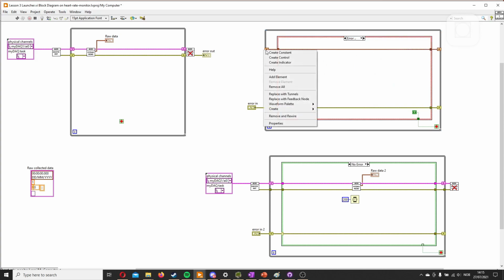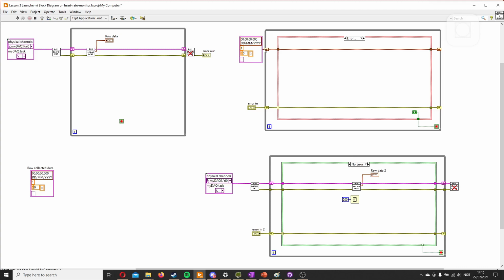It's important to have a constant on the input of a shift register, or else it will take the last input it had, so from the last time it ran. You could want it for certain applications, but then there's probably better ways of storing the data. But for this one, I want to start clean every time I start the application, and therefore I have an empty constant. We have now transferred everything from this original loop to these loops, so we can just delete this one.